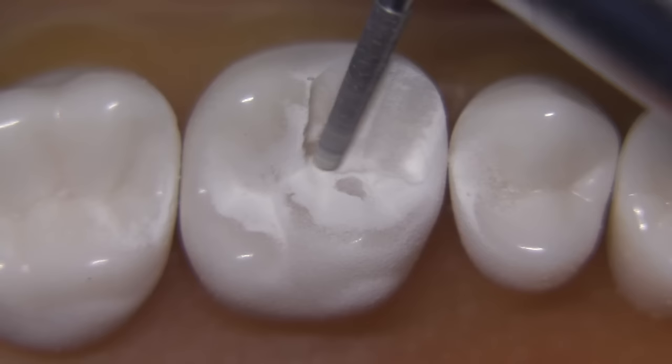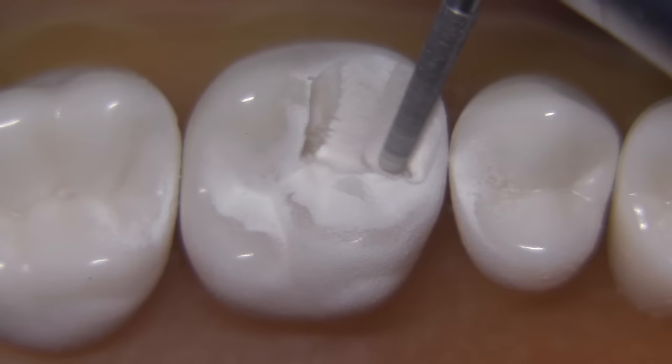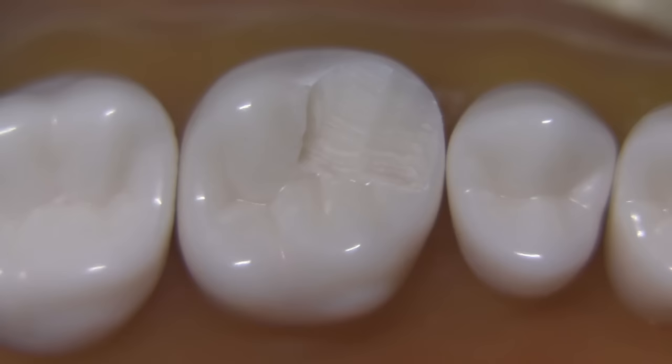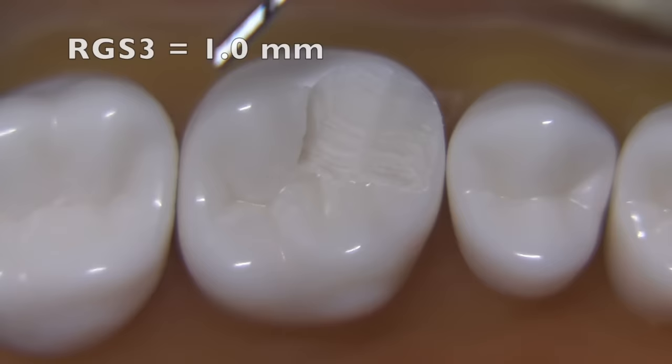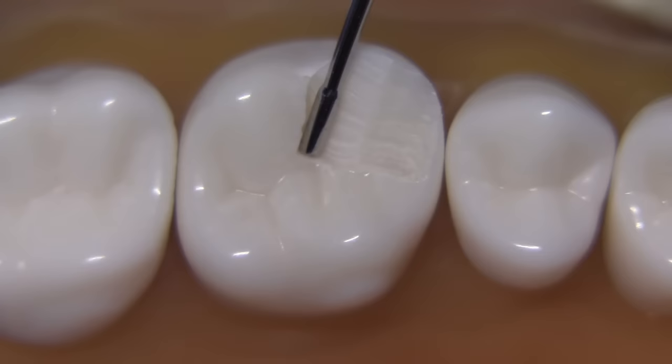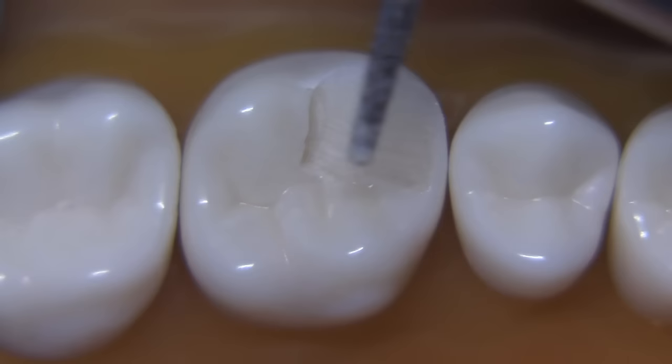This technique utilizes making distinct planes — here's one of four that will go across the facial — that can be measured by looking at the end of the burr and how it relates to the unprepared tooth structure. It's a very predictable technique to obtain accurate, adequate, appropriate occlusal reduction and occlusal clearance. You can see I'm using the burr to focus on one plane at a time, not moving the burr haphazardly. Using the RGS-3, which measures one millimeter in diameter, you can measure the ledge created. Using the RGS-4, which measures 1.5 millimeters, you can see it's just about 1.5, giving a good idea of how much has been reduced.